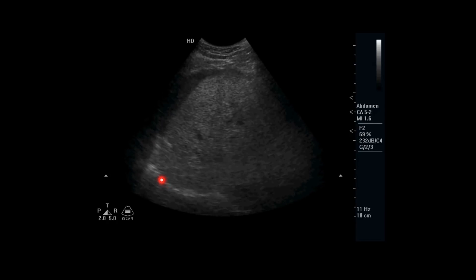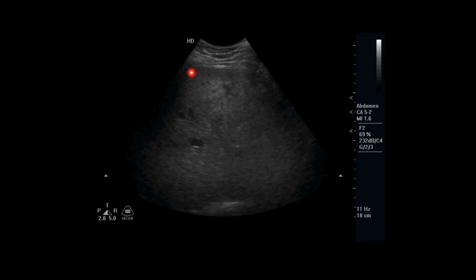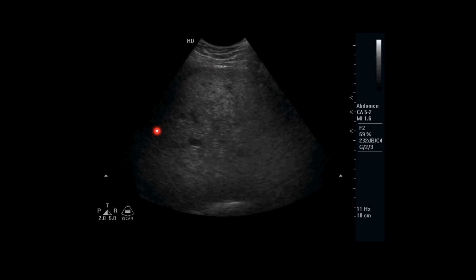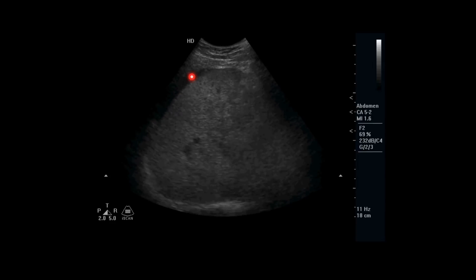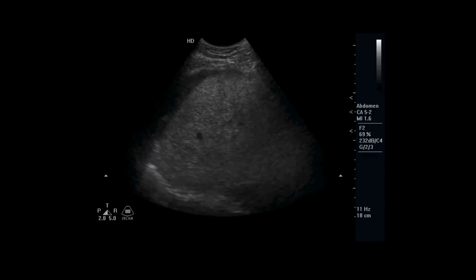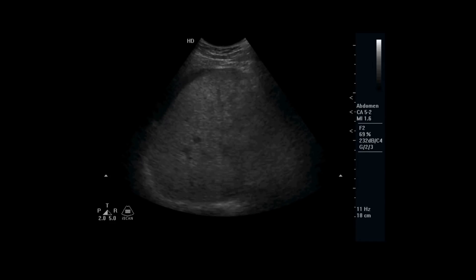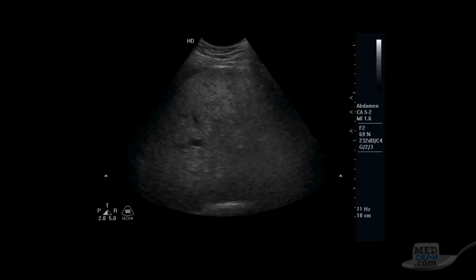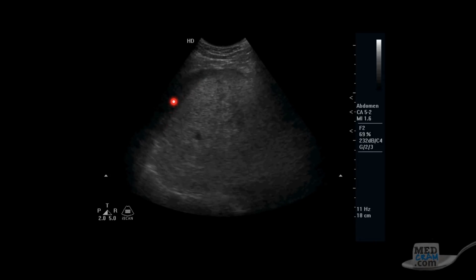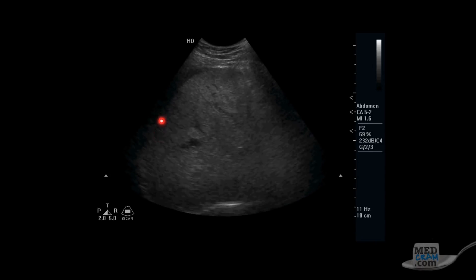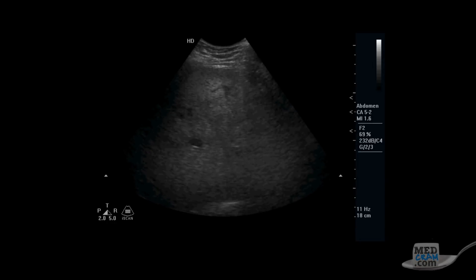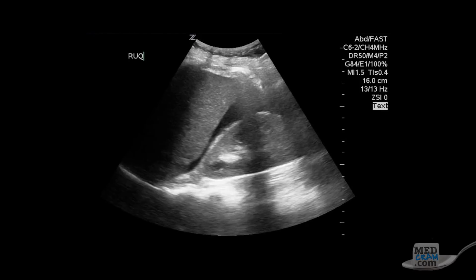This is our first abnormal example. Focusing on the subphrenic area underneath the diaphragm, we see a hypoechoic fluid collection under the diaphragm above the liver, and the echo texture of the liver looks different. In this case the patient had a liver laceration with hemoperitoneum in the right subphrenic space — this is a positive FAST exam.